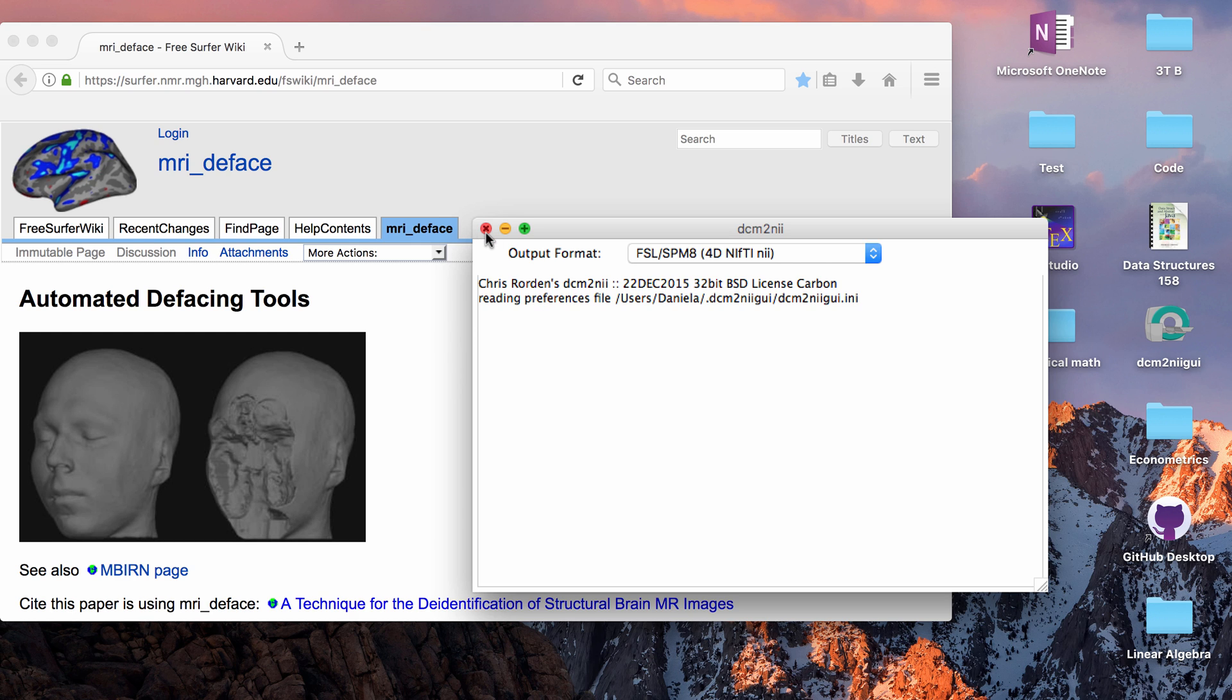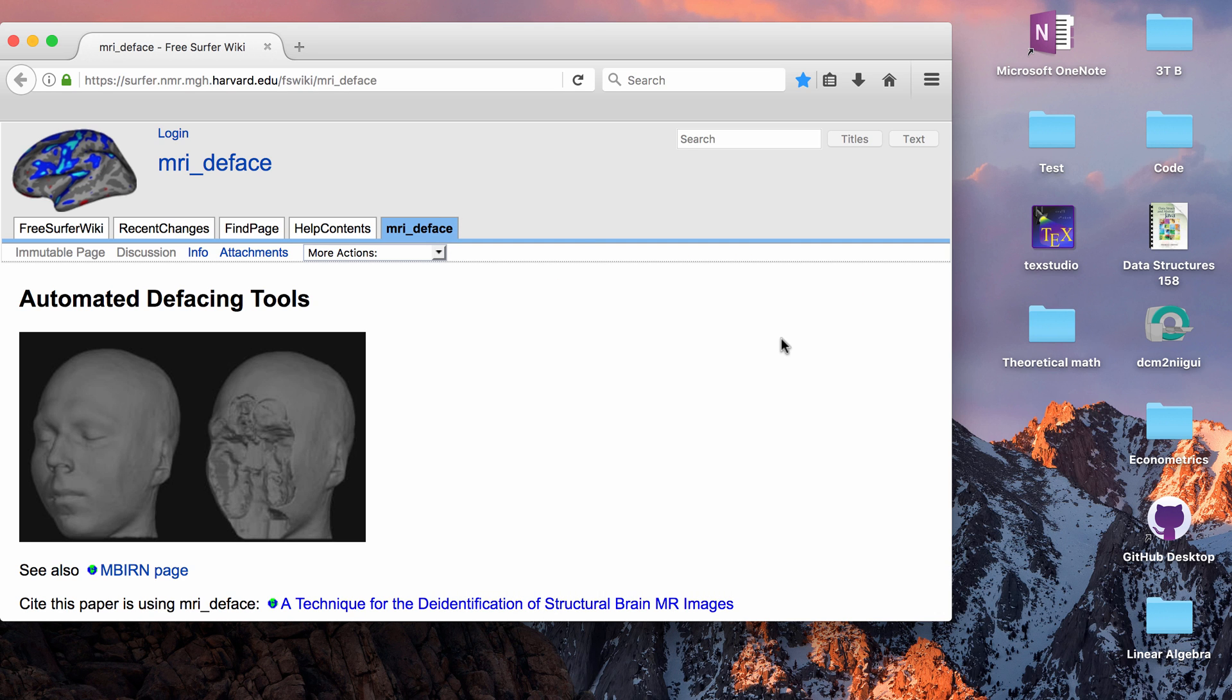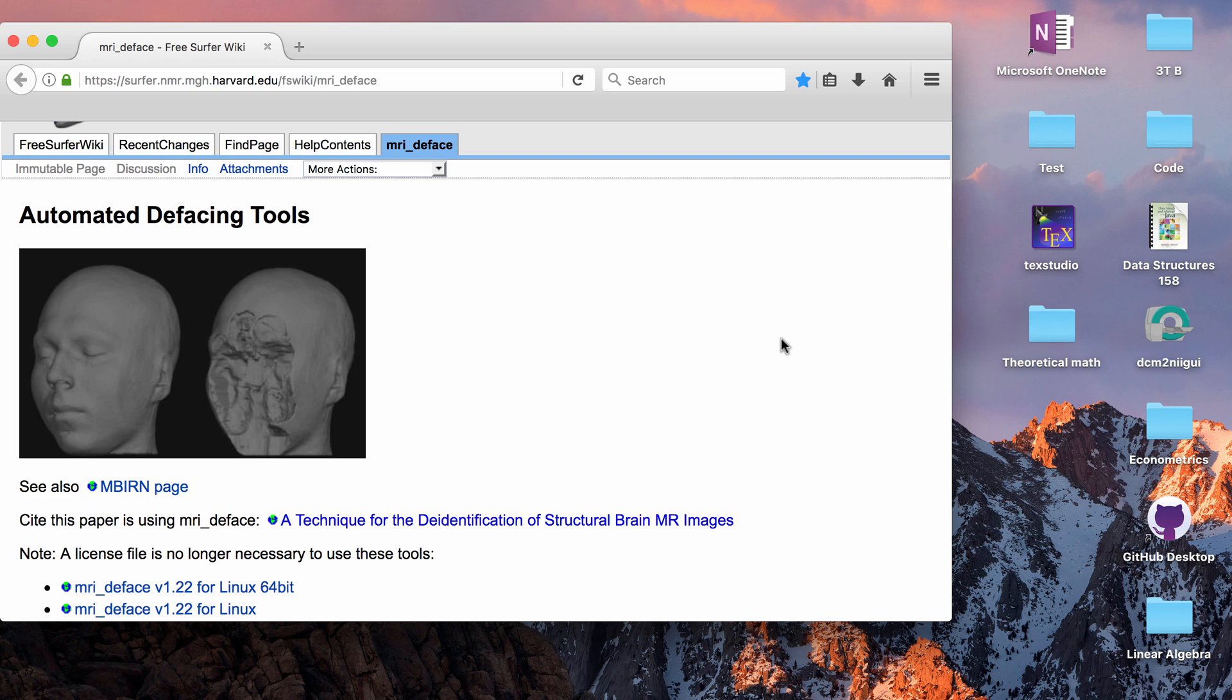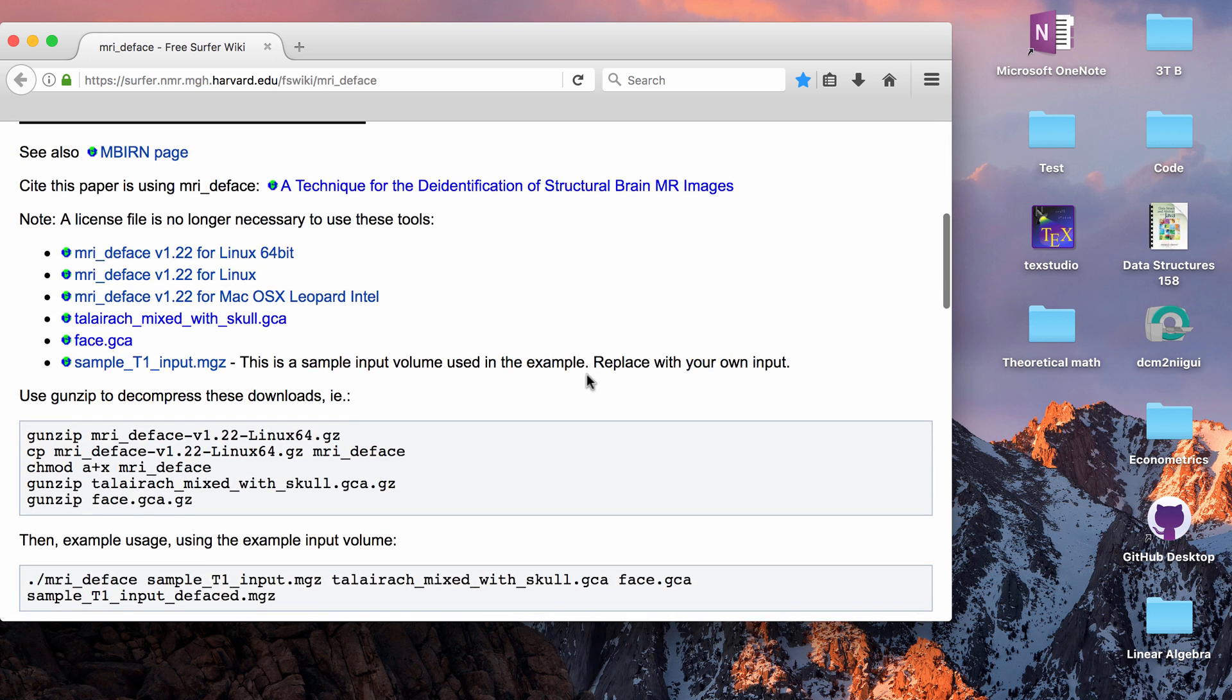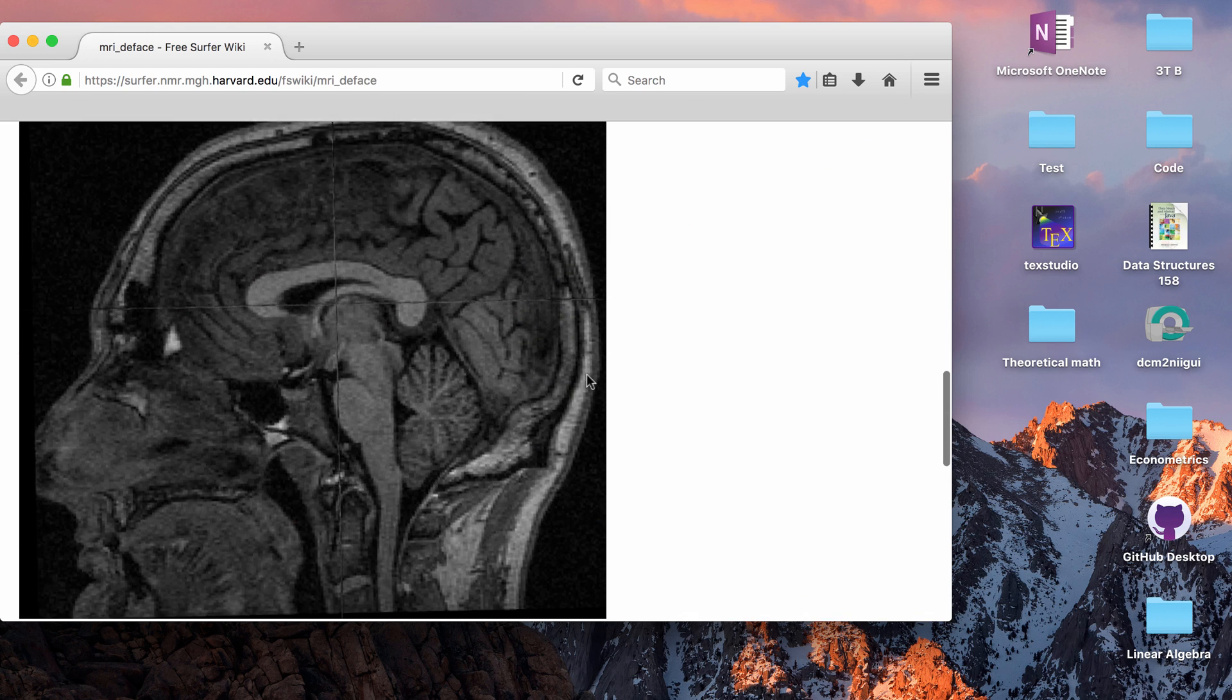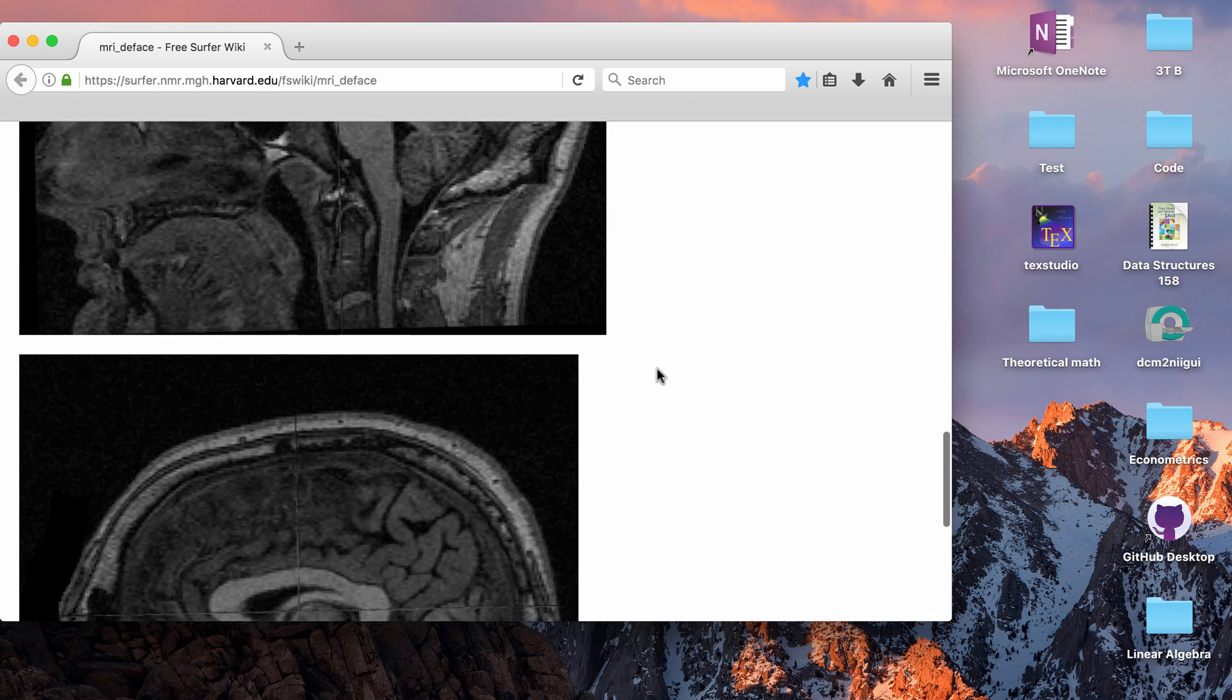So that is removing identifiable data from the headers. Defacing we'll talk about next. As you can see, it removes the facial features of an image. So this is usually a NIFTI or you can be converting from an MGZ, but that type of three-dimensional file.